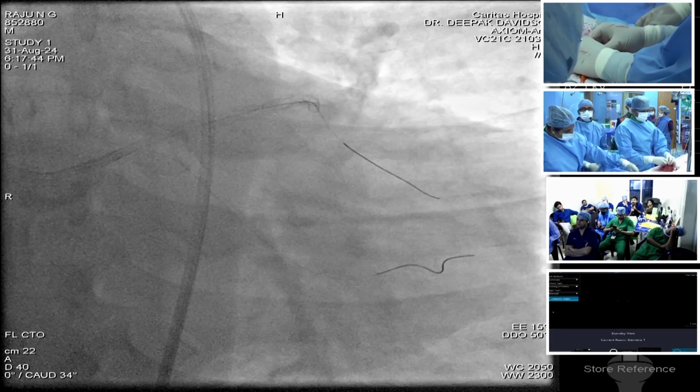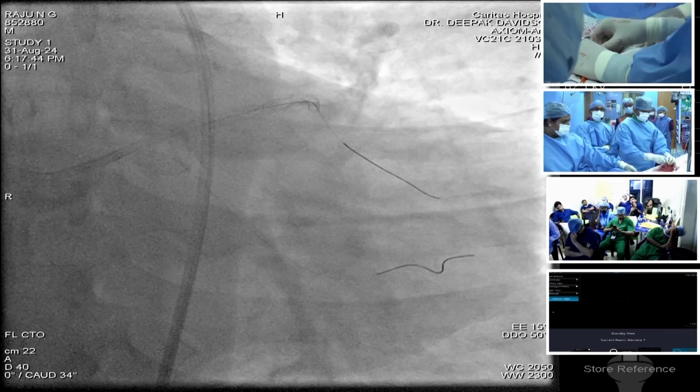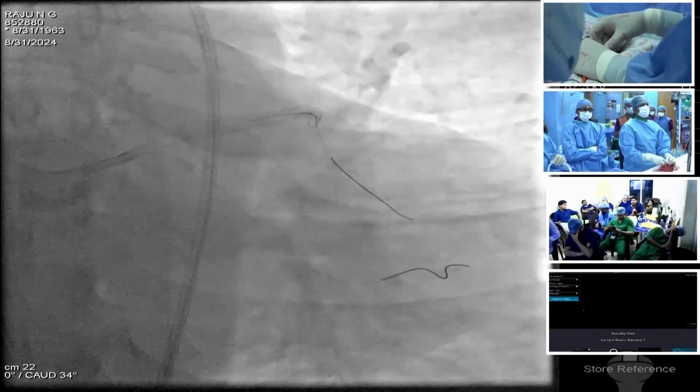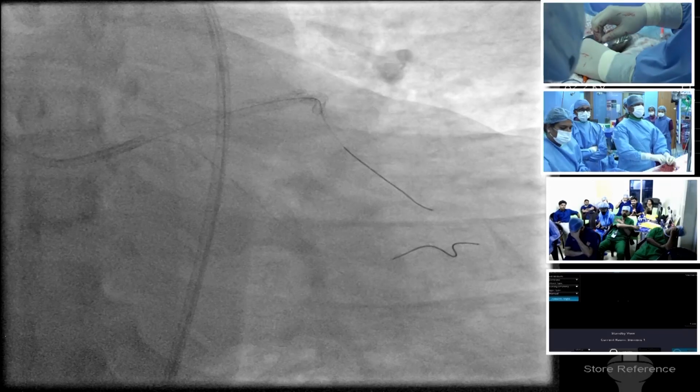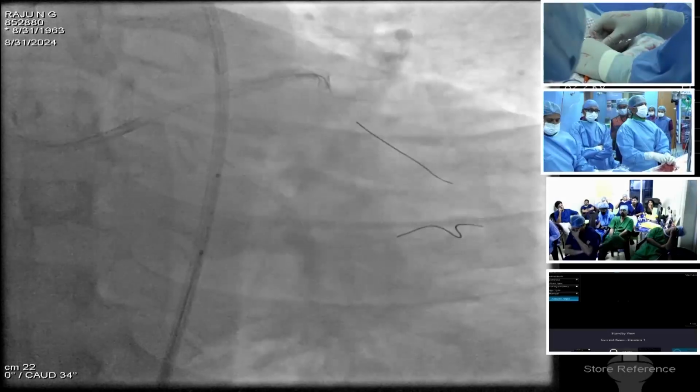Planning DK crush or mini crush? Mostly here we try to do DK crush. Mini crush we never do. At times T-and-protrusion. Culotte is very rare. Mini crush, technically, is much simpler.